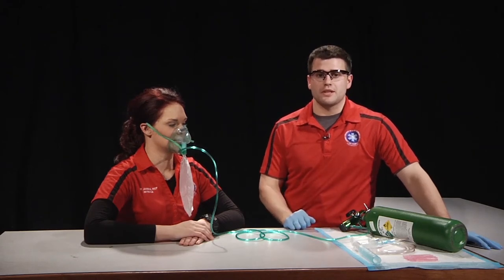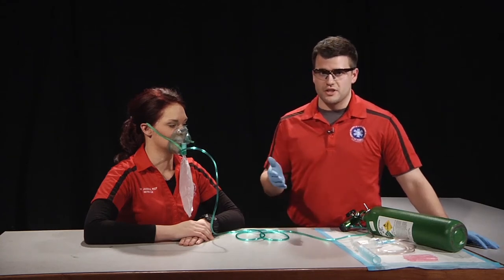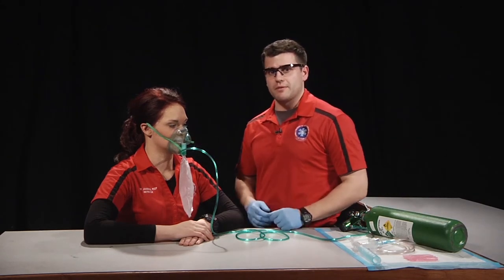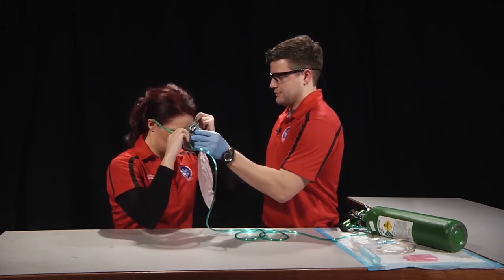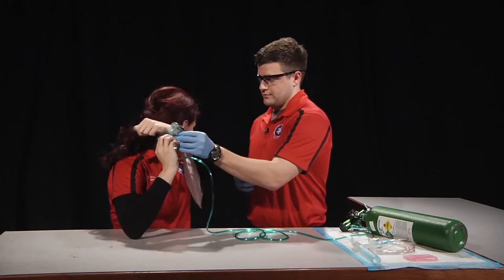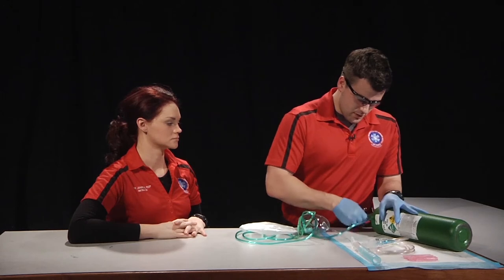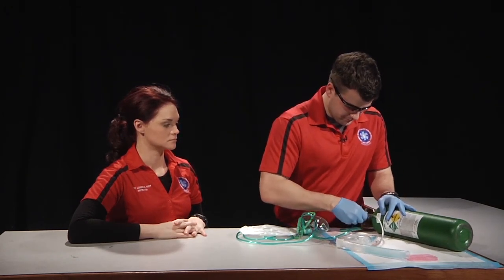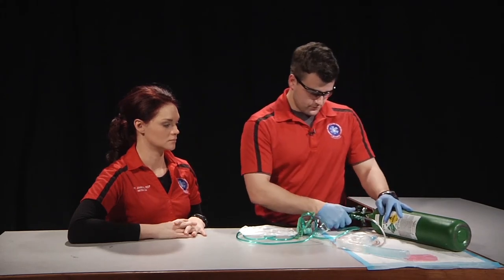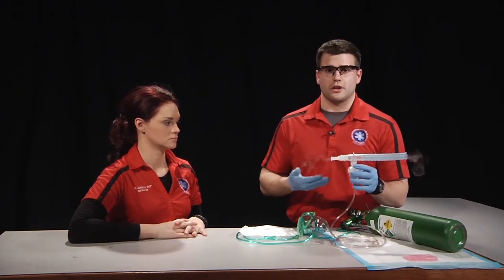Now that we've properly demonstrated how to assemble and administer medication via nebulizer, we're going to show you how to coach a patient to use the nebulizer. Our first step will be to have the patient remove the non-rebreather mask. From here, we'll turn the oxygen bottle off, disconnect our non-rebreather, and connect our nebulizer.